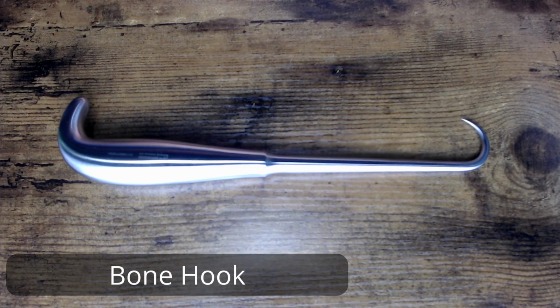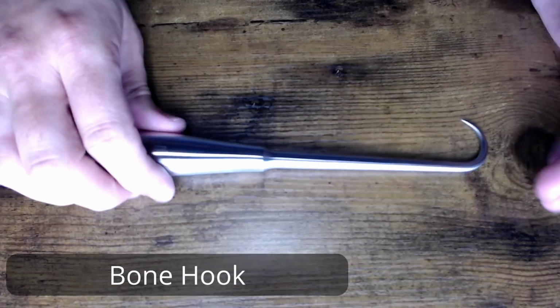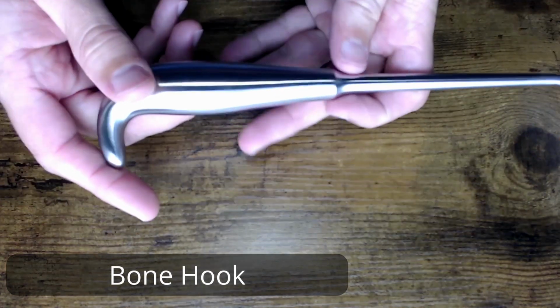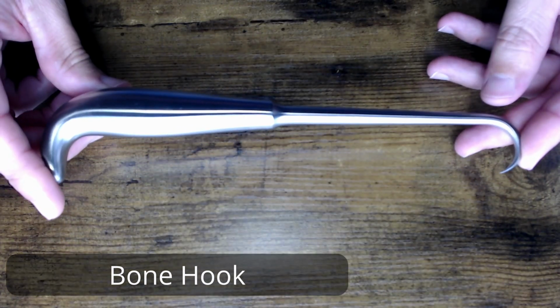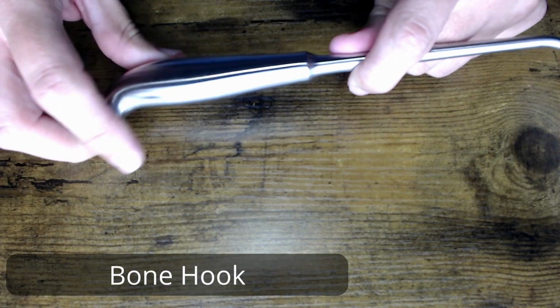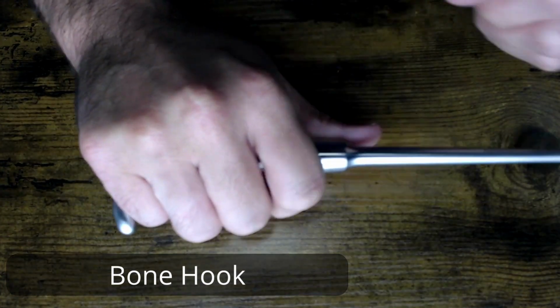Hello, my name is Bone Hook. We got a fun one here for you today. This is a large bone hook. These bone hooks come in all shapes and sizes. You even see some handles. You kind of see a standard handle here. This is a solid handle. But sometimes you'll see that kind of T handle in your bone hook. The T handle allows for a different holding pattern. This one has that ergonomic hold here to kind of stop your finger there on the back side.